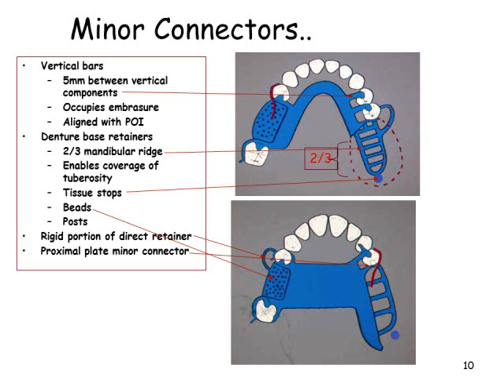The minor connector for the lower distal extension base should extend posteriorly about 2/3 the length of the edentulous ridge, and have elements on both the lingual and buccal surfaces. Not only will such an arrangement add strength to the denture base, but in all probability it will also minimize distortion of the cured base from its inherent strains due to processing. The minor connector must be planned with care, so that it will not interfere with the arrangement of artificial teeth.